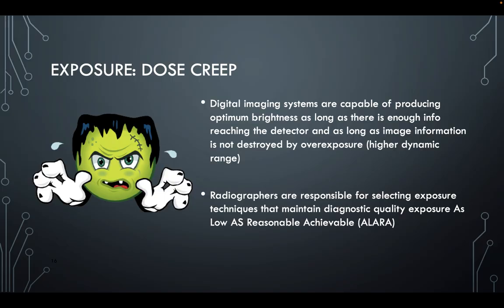So, to be a quality technologist, you want to use all of the concepts that we're teaching you and keep your doses as low as possible. Not only is that going to protect your patient, but if for any reason someone needs to hold, especially if you're on portables or in the OR using a C-arm, you're going to protect yourself and everyone else around you as well.